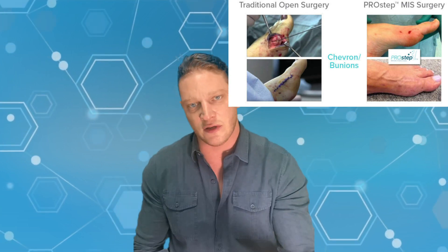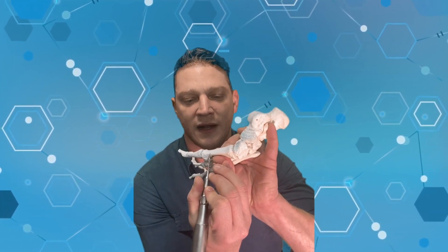With the minimally invasive procedure, we make a keyhole incision — a little tiny poke with a 15 blade, maybe less than a centimeter — and right there we make the cut at the metatarsal through fluoroscopy, which is a live x-ray. I'm looking up at a TV. I'm using this exact tool — this is the burr. It's attached to the Pro-Step computer, and what the computer does is detect the torque going through it, so it knows when it's cutting bone and when it's pulling up anything that shouldn't be cut, and it will instantly stop to protect the patient.